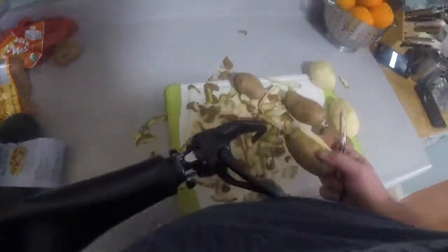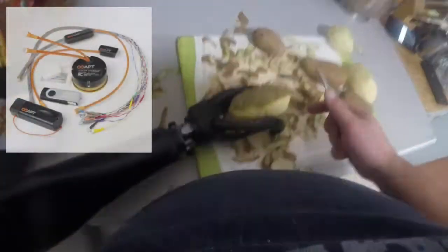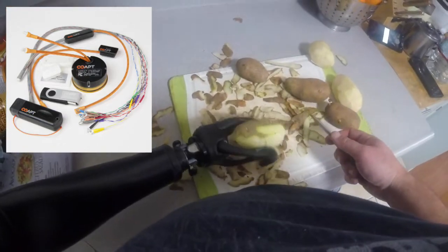In a sense I do use my mind to contract those new muscles, but that's not what makes my arm move. The other mind controlling my arm is powered by a Coapt Generation 2 complete control device.